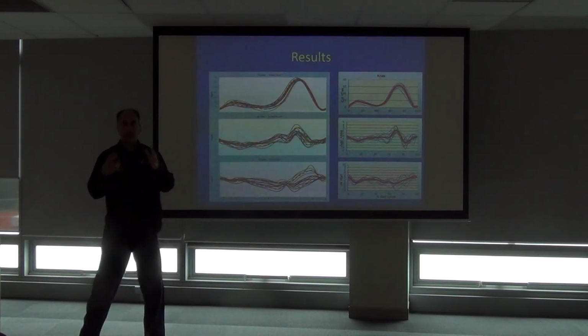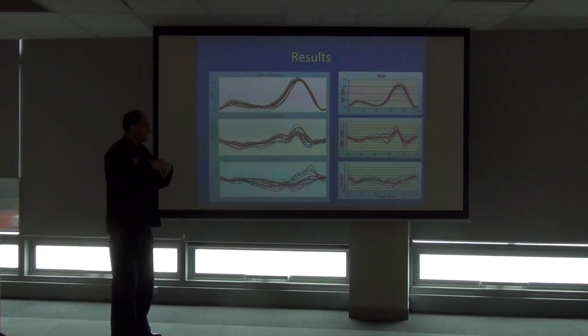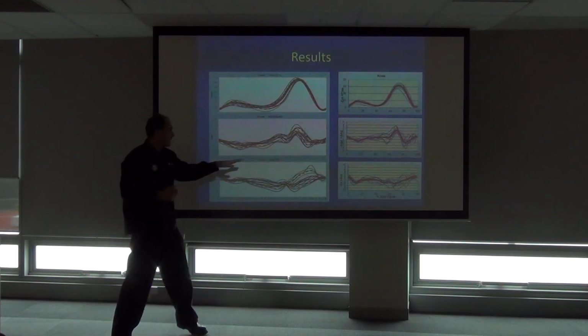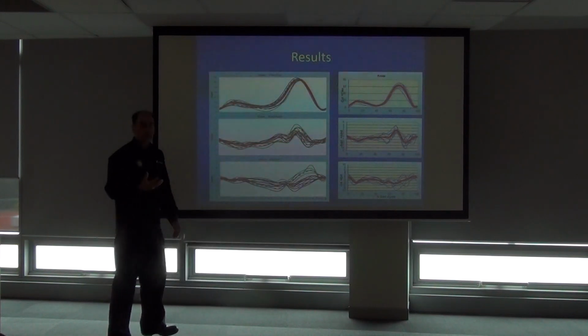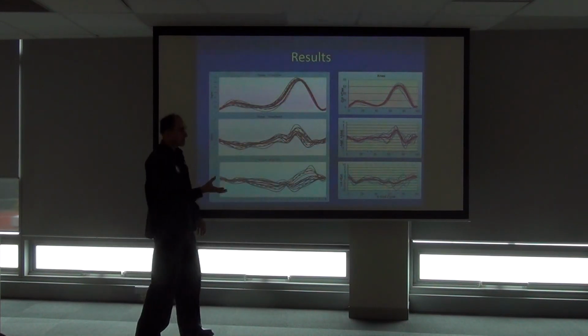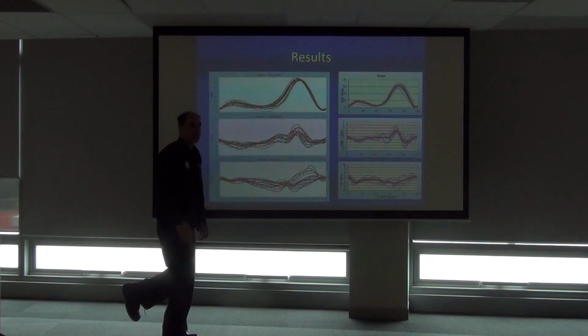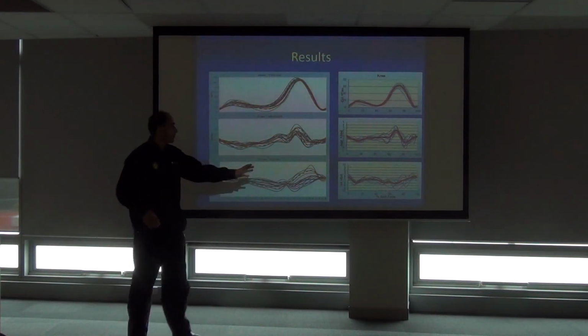If you look at the criterion values and similar different unrelated paths, the biggest variability between subjects is knee internal external rotation, and that is here, the swing phase. So there's some distinct variation in internal external rotation as the lower leg comes through, so internally or externally rotating. And that was the biggest relative variability of all the measures.